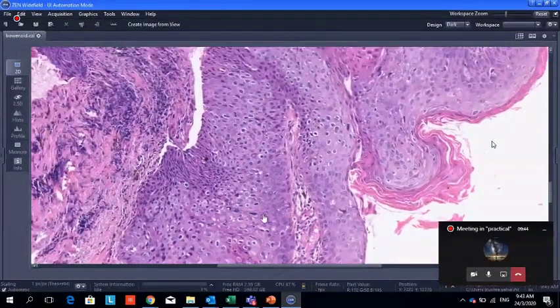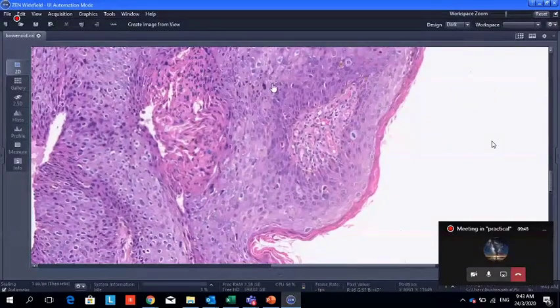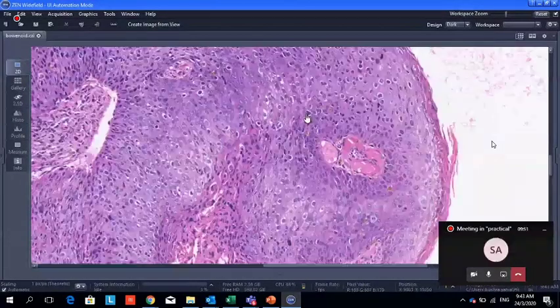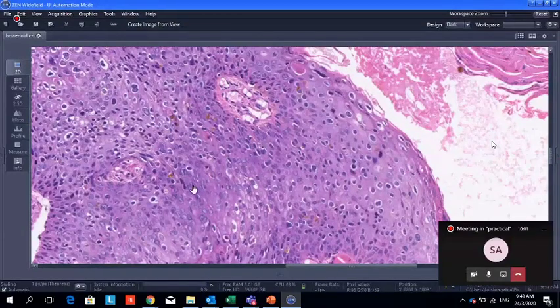Hyperchromatic cells, meaning dysplasia, right? Yeah, all of them look like the basal layer. Is there any difference between the basal layer and the outermost layer? No, same, isn't it? That means there is loss of maturation of the epithelium.